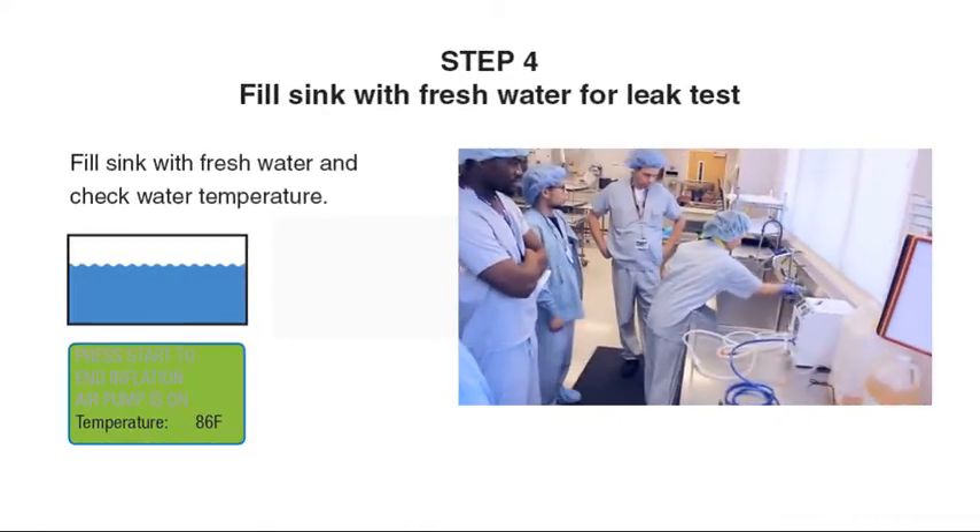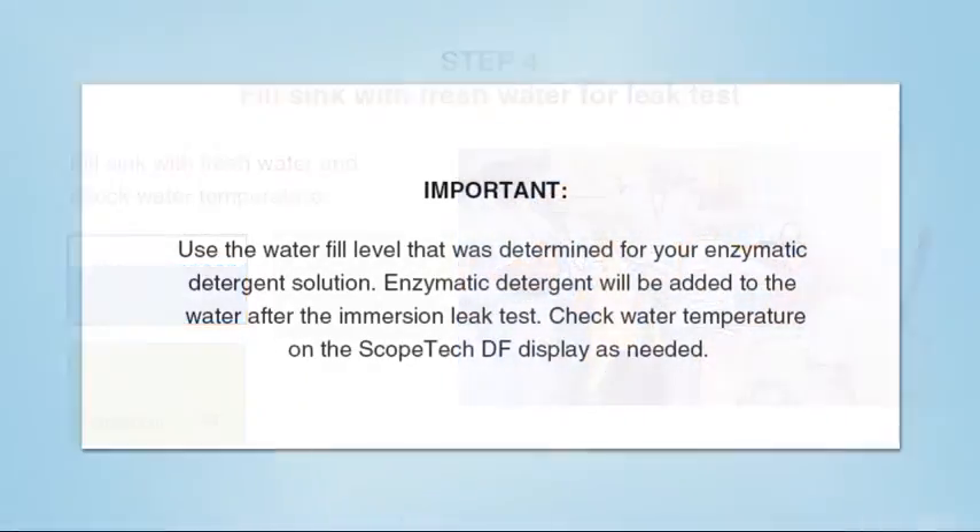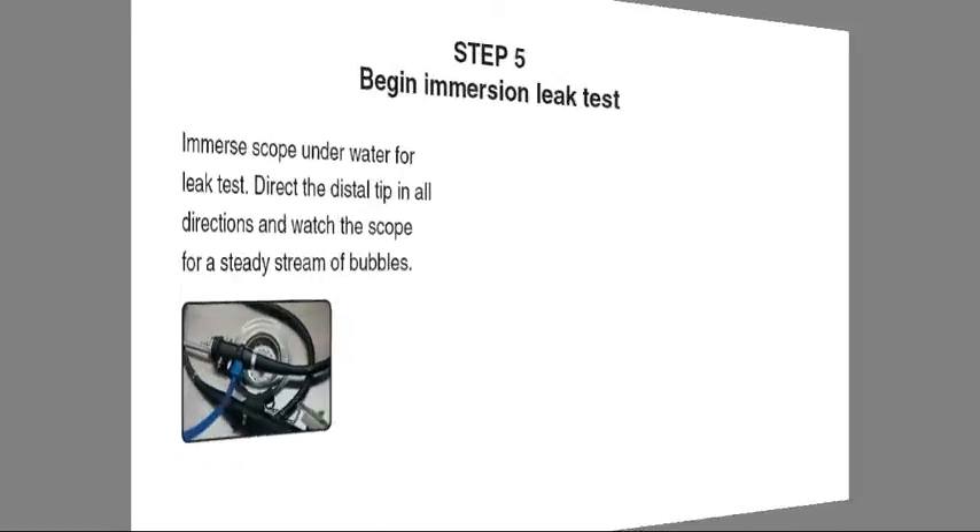Step 4: Fill the sink with fresh water for the immersion leak test. Use the water fill level that was determined for your enzymatic detergent solution. Enzymatic detergent will be added to the water after the immersion leak test. Check water temperature on the Scopetech DF display as needed.